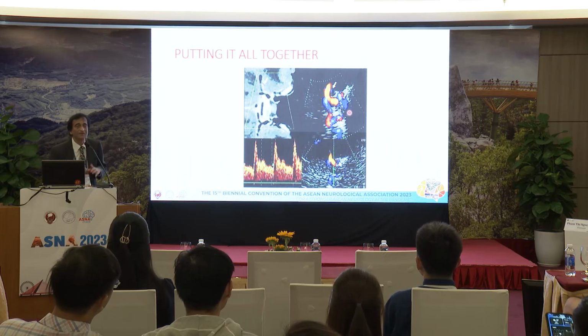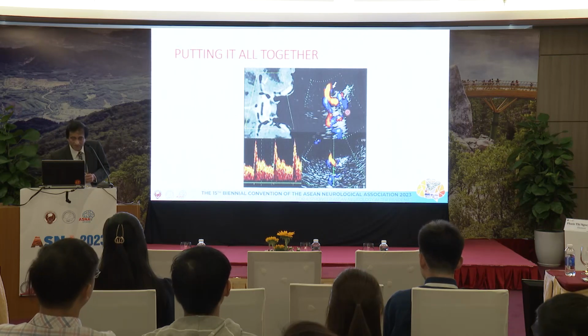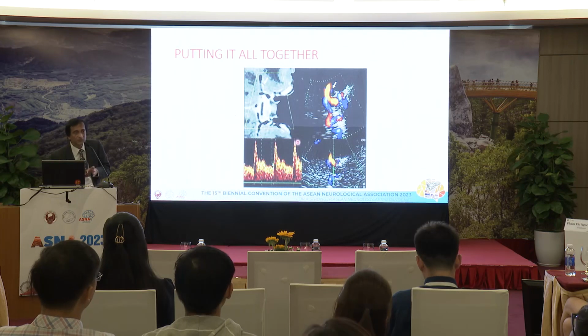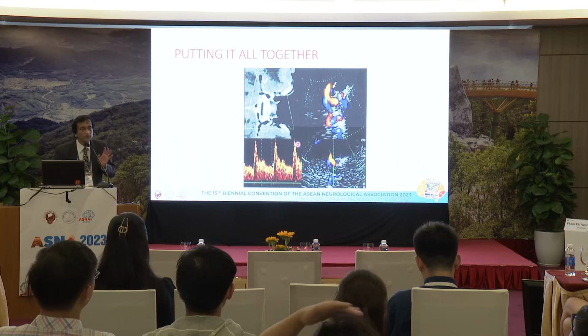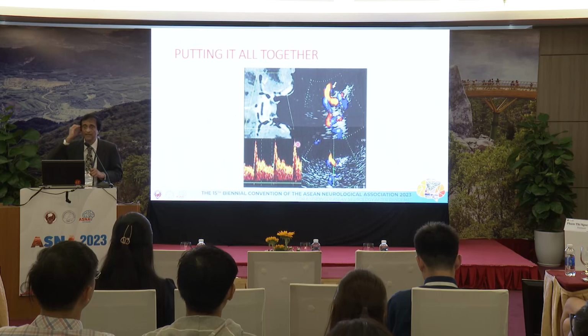Exactly here you see on your TCCD the MCA, the PCA here, MCA, ACA, and the opposite side vessels too. All very beautifully seen. Then you put the Doppler mode in the right location. So this is how we do the transtemporal TCCD to detect MCA, ACA, PCA, and terminal ICA.